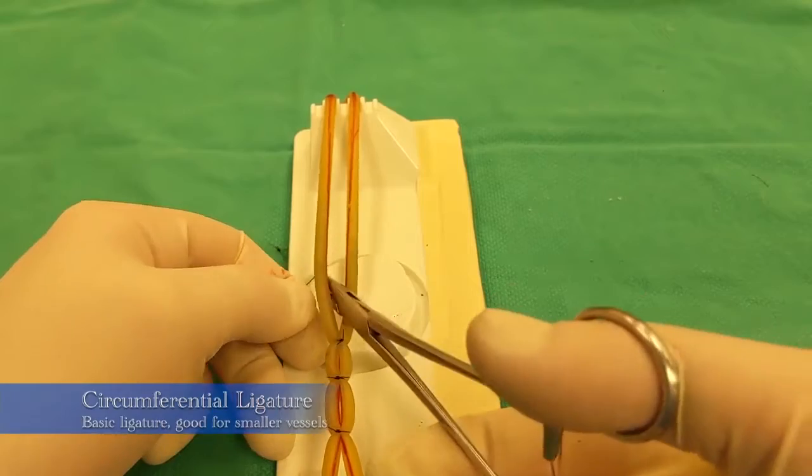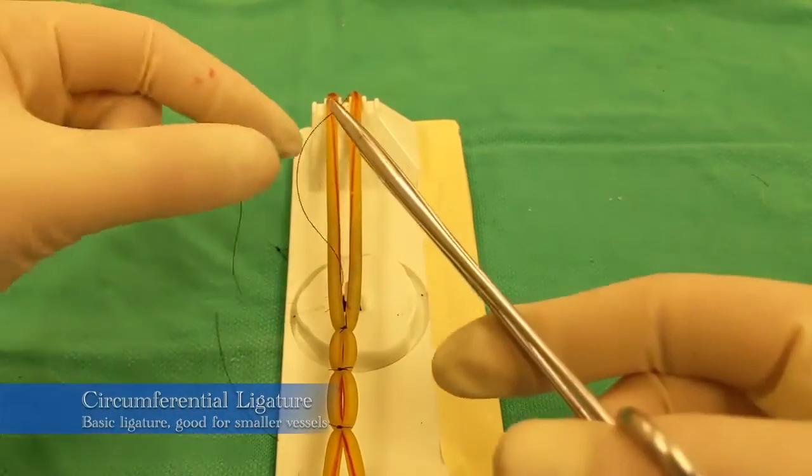For a simple circumferential ligature, you'll just wrap your suture around your model vessel once.